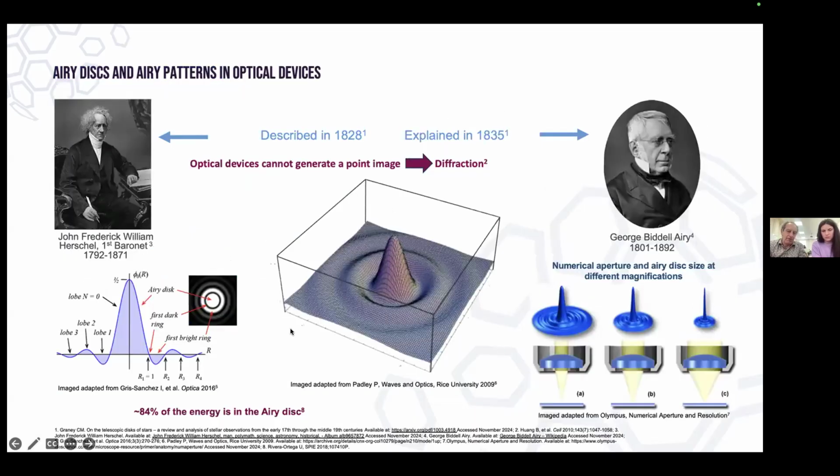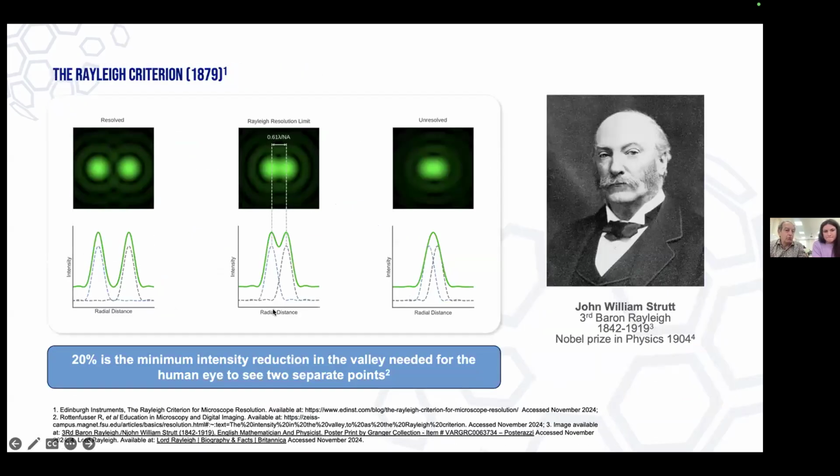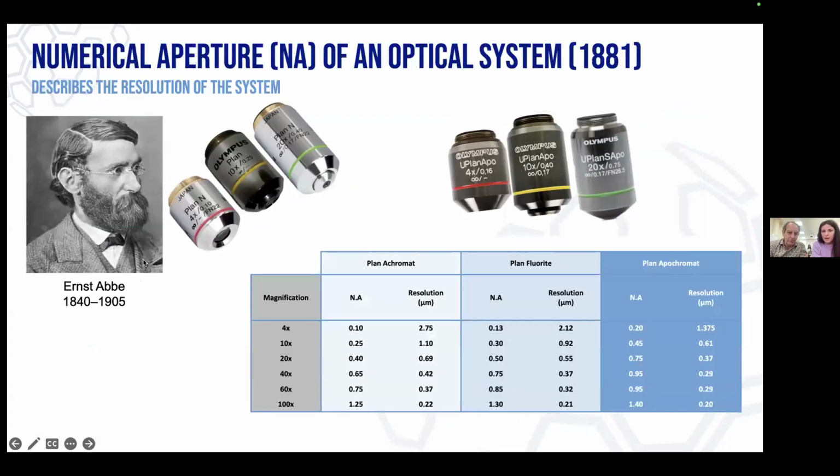The basis of the magnification rule, which we will not go into, is the fact that each lens has a different power of resolving 2 points that are close together. So that's resolution. Not magnification, but resolution. Basically, the optical systems are such that the moment two points are too close together, you don't see 2 points, you see a blur. So here you see blurring, not sharp membrane staining. Here you see sharp membrane staining. This separation depends on the quality of the lens you use, and also the magnification as well.